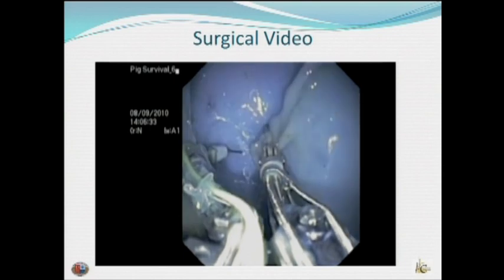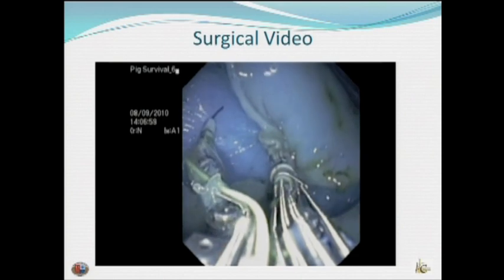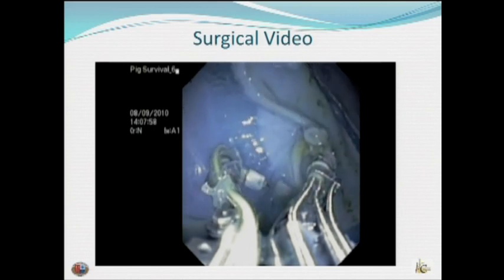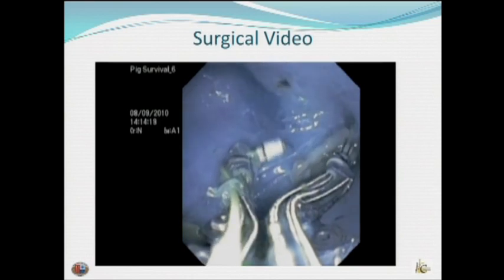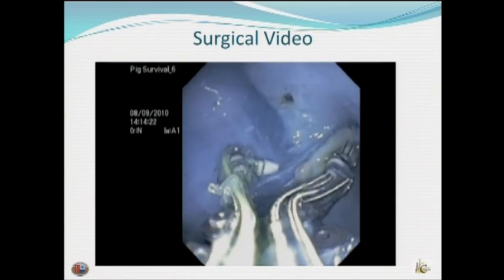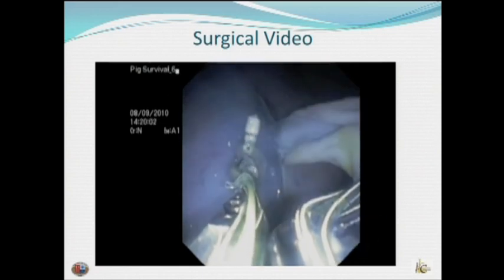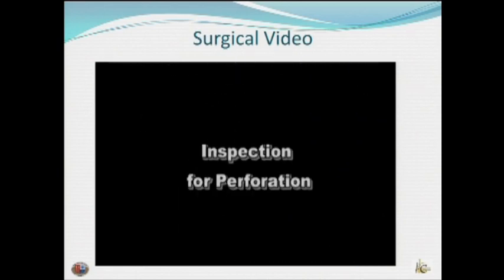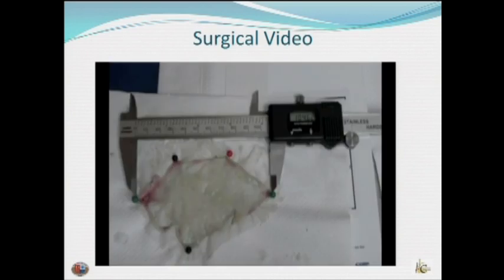One arm is the grasping arm, the other arm is the monopolar diathermic hook. So it helps in the triangulation, so dissection and retraction can be done under vision to prevent any complications. And if there is any complication, it can be dealt with easily at the same time. This is the picture at the end of the endoscopic submucosal dissection, to check for any perforation or bleeding, and the size measurement.